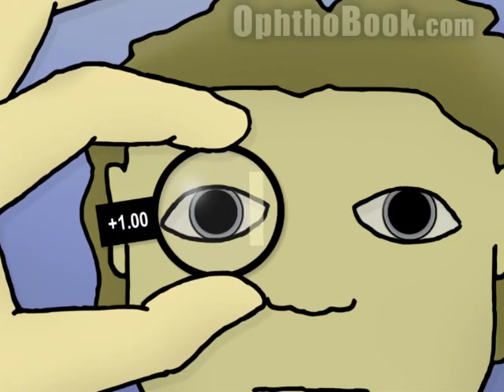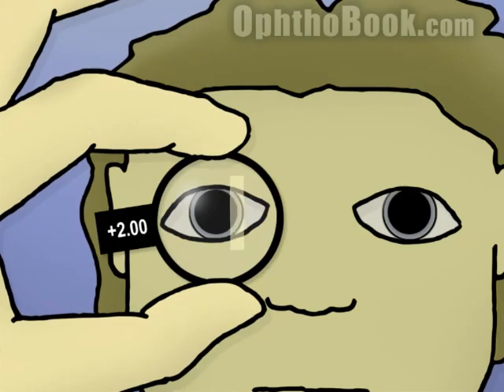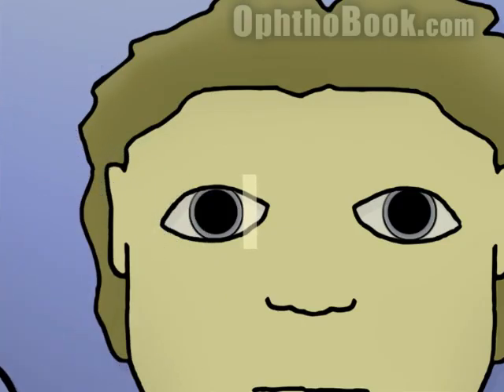So let's hold up a plus one lens, add a little bit of power — the reflex is still going in the same direction. You notice that the red reflex, that line back there, looks a little bit thicker than before, so it's gotten a little bigger, but we still have 'with' motion. So let's add a plus two. Still going 'with', not quite there yet, but the red reflex has gotten bigger. We're getting closer to our ideal, perfectly focused situation.